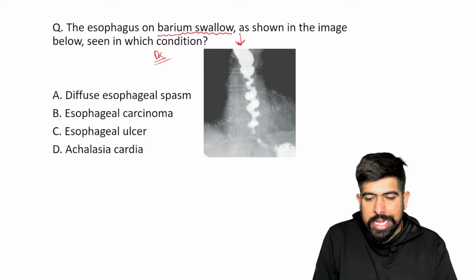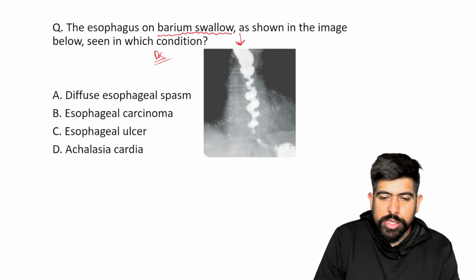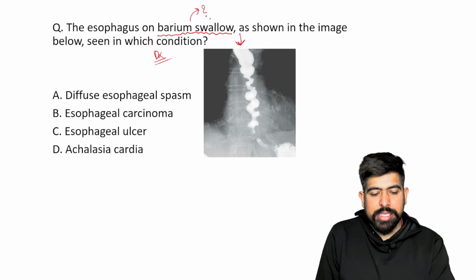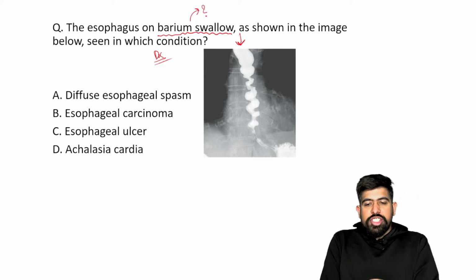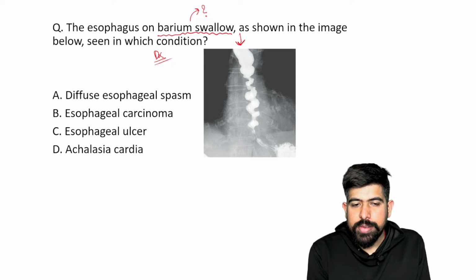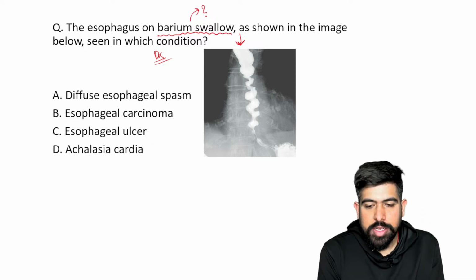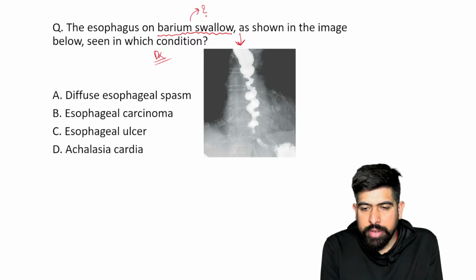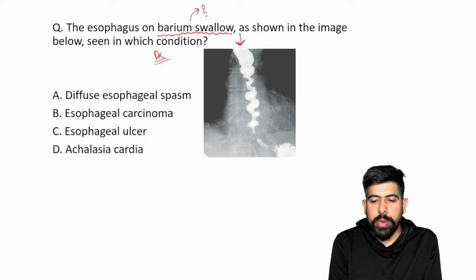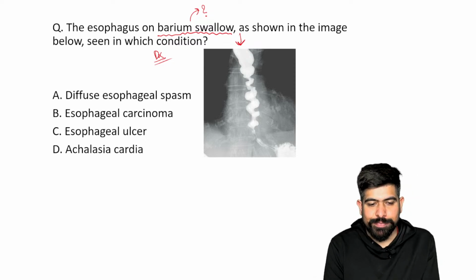The corkscrew appearance. But first of all, tell me, what is the barium swallow? I want to ask you something different. Just tell me in the chat box. What is the barium swallow? I'm waiting for 20-30 seconds. No issues. Try to reply in the chat box. What is this test, barium swallow?